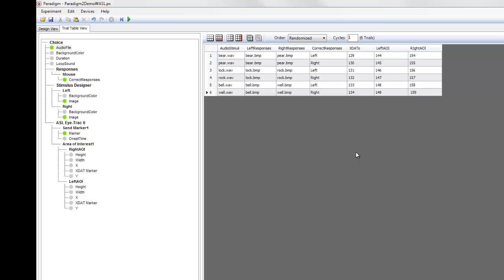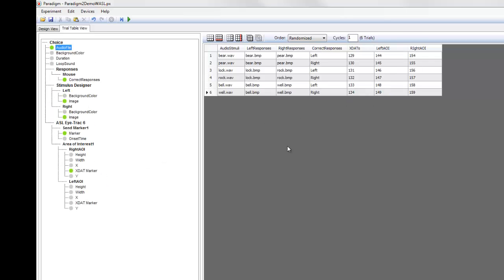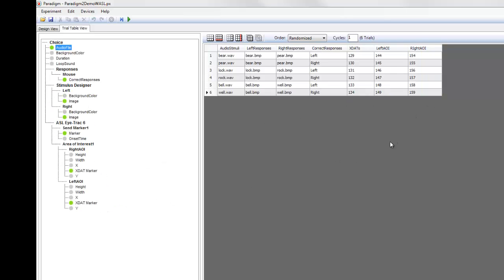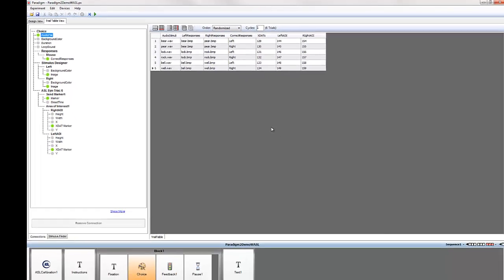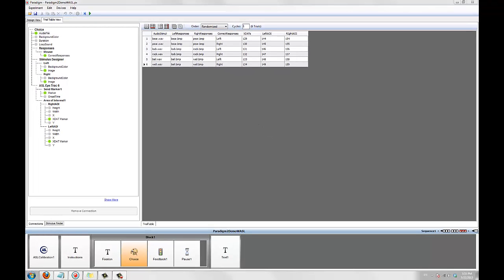And then create a connection between the x-stat marker properties of the right AOI and left AOI, and these two columns. So now we'll see a unique set of x-stats appear for each trial's detected fixations. Also note that you can change the location and size of the AOI for each trial using connections as well. So that allows you to create dynamic AOIs that vary with each trial.